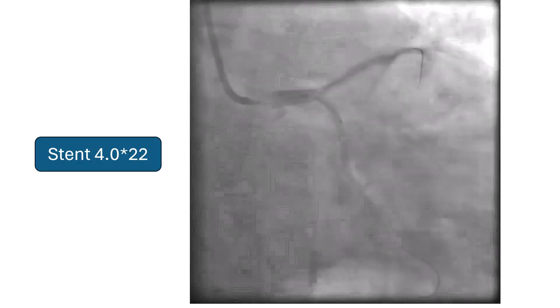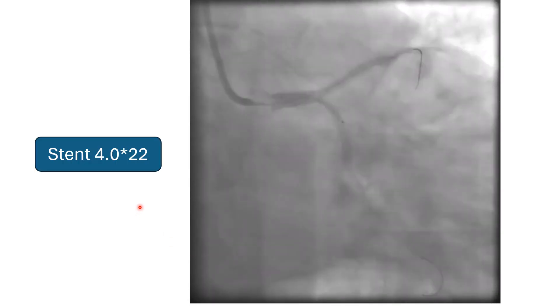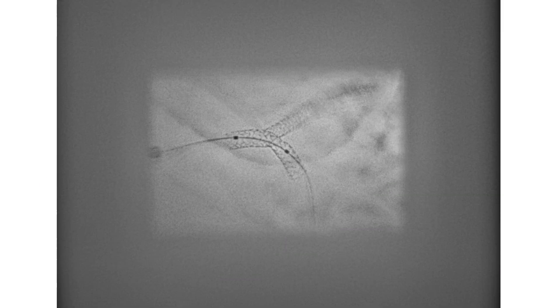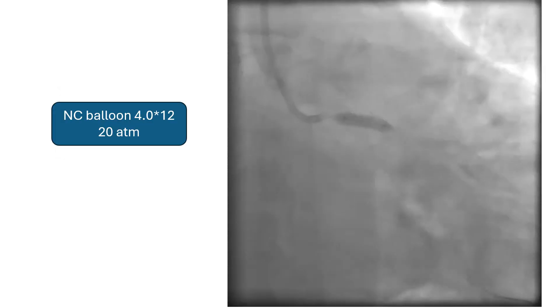Going back to our case, a 4.0 by 22 mm stent was positioned in the proximal circumflex extending into the left main stent. The stent was deployed. Stent enhancement showed an under-expanded mid part of the stent, so it was post-dilated with a 4.0 by 12 mm balloon up to 20 atmospheres. Kissing inflation was then done.